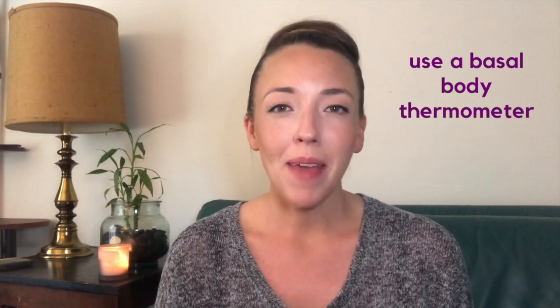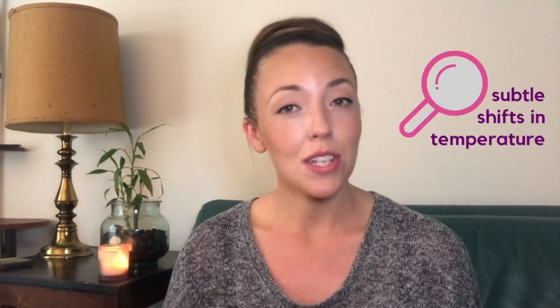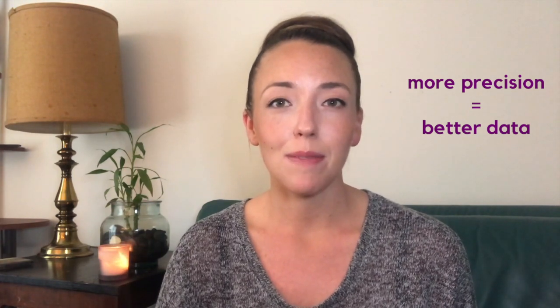Number 3 is that you want to get yourself a basal body thermometer. Now, the main difference between this type of thermometer and a regular thermometer is that it measures your temperature to a 100th of a degree versus a 10th of a degree, like a regular thermometer does. And the reason that's important is because it gives us more precision, more accuracy in your temperature data, and we are oftentimes looking for very subtle shifts in your temperature. So the more precision we have, the more we can see those shifts in temperature. So it actually ends up being very important in the practical application of the fertility awareness method. And you will start to see that yourself as you use the method more.